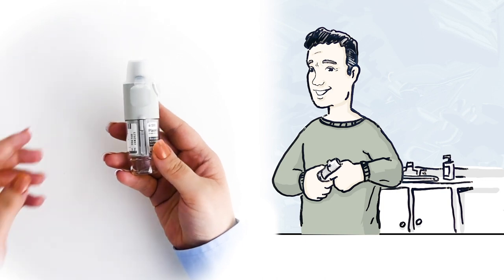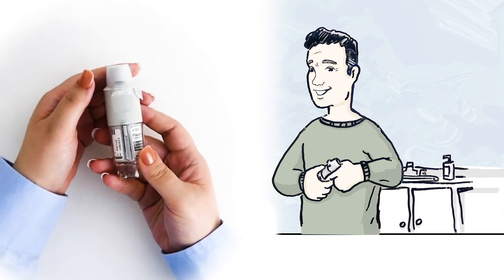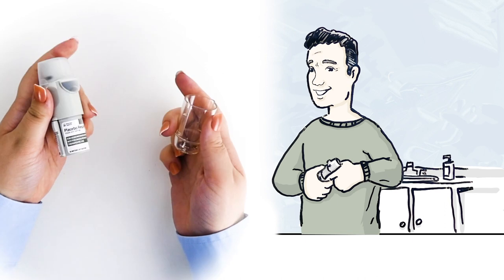First, press the gray safety catch button. Then with the other hand, pull down on the clear base. This lets the two pieces come apart.